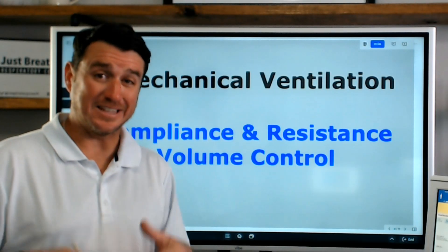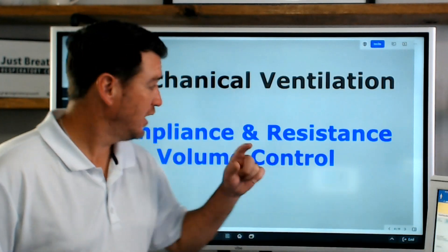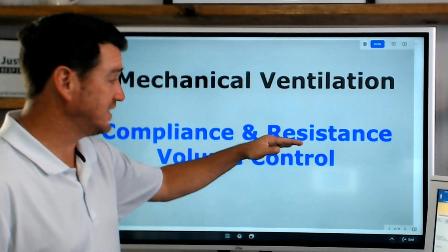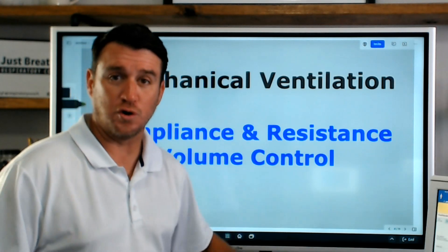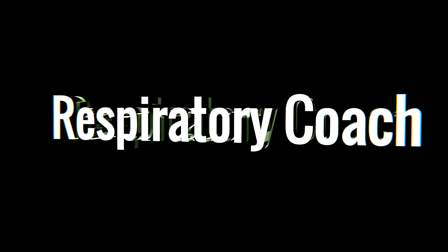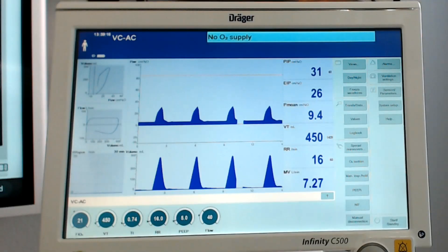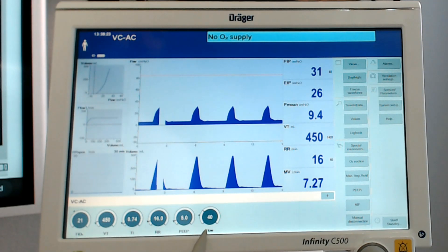What's up future respiratory therapist! In this video, we're going to be using the Draeger ventilator to look at compliance and resistance and how that affects parameters in volume control ventilation. Let's dive in. So we're here in volume control. We have a set tidal volume of 450 milliliters, a flow of 40 liters per minute, a PEEP of five, and a rate of 16.